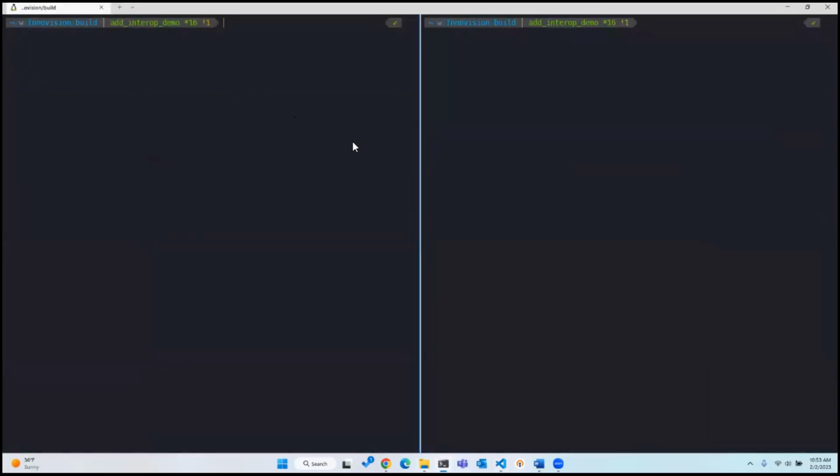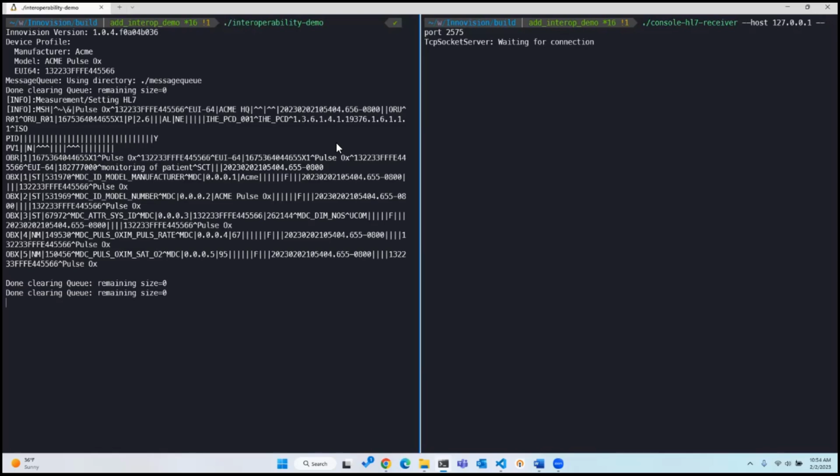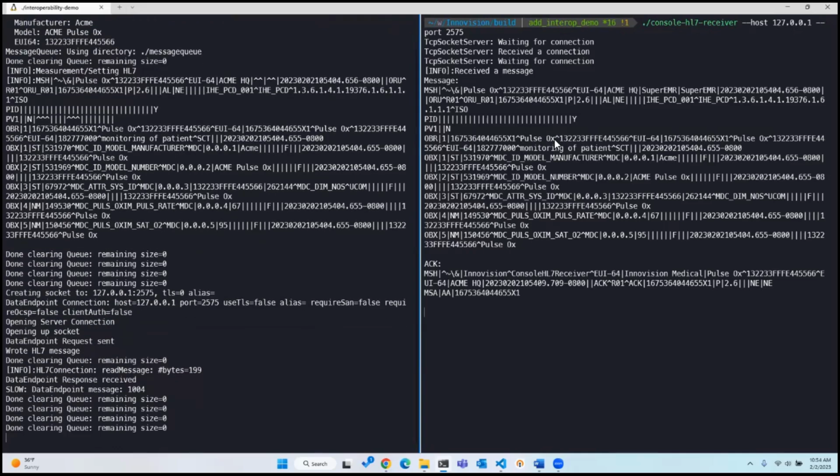Okay, here I have my console window up. On the left-hand side, I'm going to run the demo. And on the right-hand side, I'm going to run our quote-unquote super EMR. I'm going to do this using an HL7 receiver that I built. It's just going to echo our messages to the console. There it is. It's waiting for a connection. So now I'll run the demo. And if we just give it a moment, we are now receiving data in our super EMR.